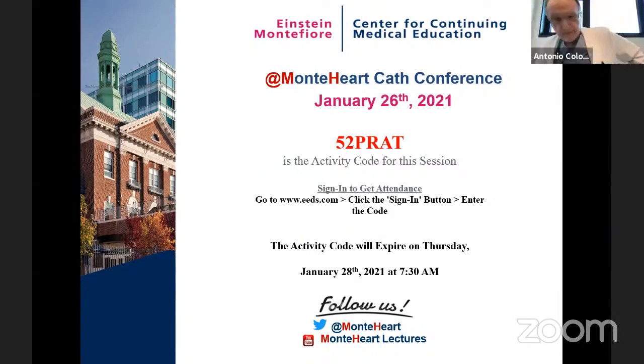Yeah, okay. Femoral has intention to treat. Not if I fail radial or radial is absent, of course. Femoral has intention to treat. When I have a very complex coronary, I prefer to go femoral. This doesn't mean that you cannot go radial, but I prefer to go femoral if I have a complex coronary.